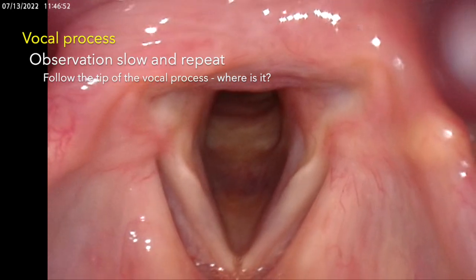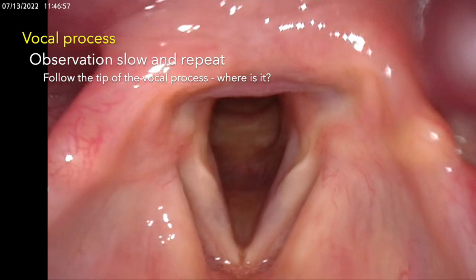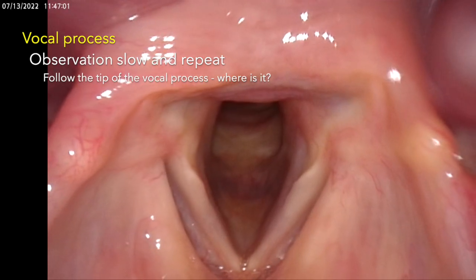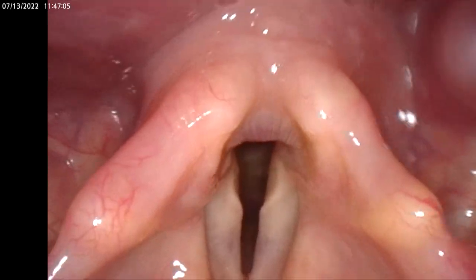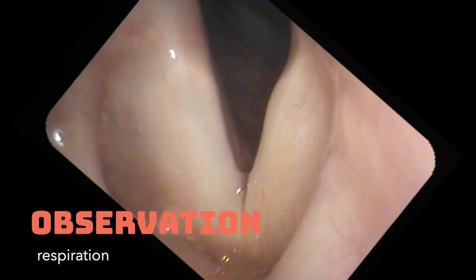So we're training ourselves to look at each vocal process, and it can be hard to look at them both at the same time. So sometimes you want to slow it down, look at the left, look at the right, and repeat. And let's move on to a case where they aren't symmetric.